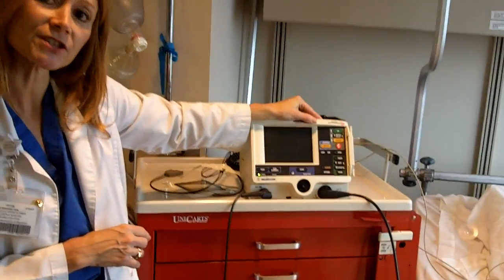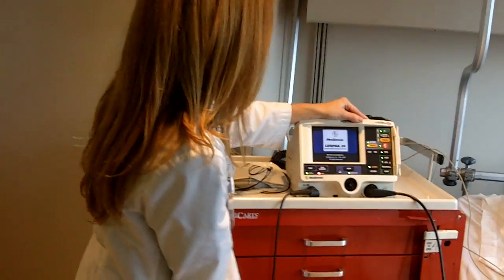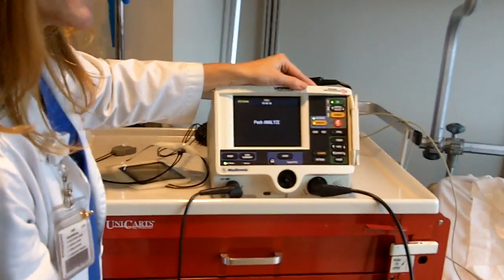I then want to use my LIFEPAK 20, which is going to provide the pacing function — this will be my pulse generator. I turn it on, select lead, and push analyze.